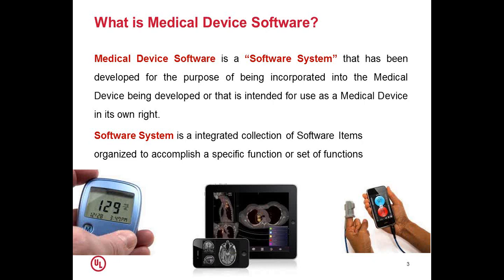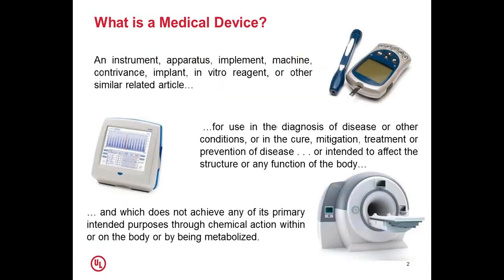So some of the software which we write for operating a medical device is also called medical device software, as well as some of the applications, and nowadays we find a lot of applications in iPhones, Android, and many other platforms which we develop also come under medical device software, if the previous definition holds good.